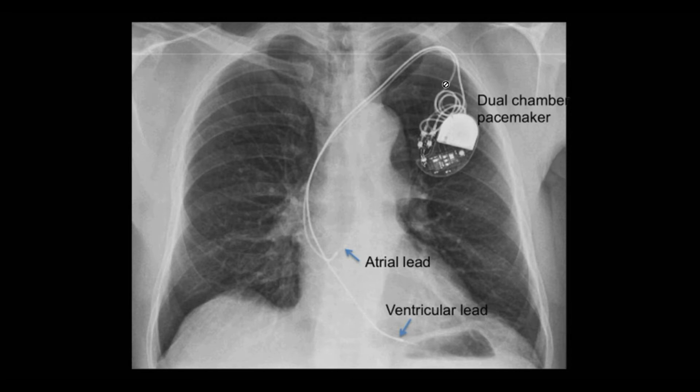As you can notice over there, there is some slack, which is important to allow slight movement of the pacemaker without the leads being dislodged.